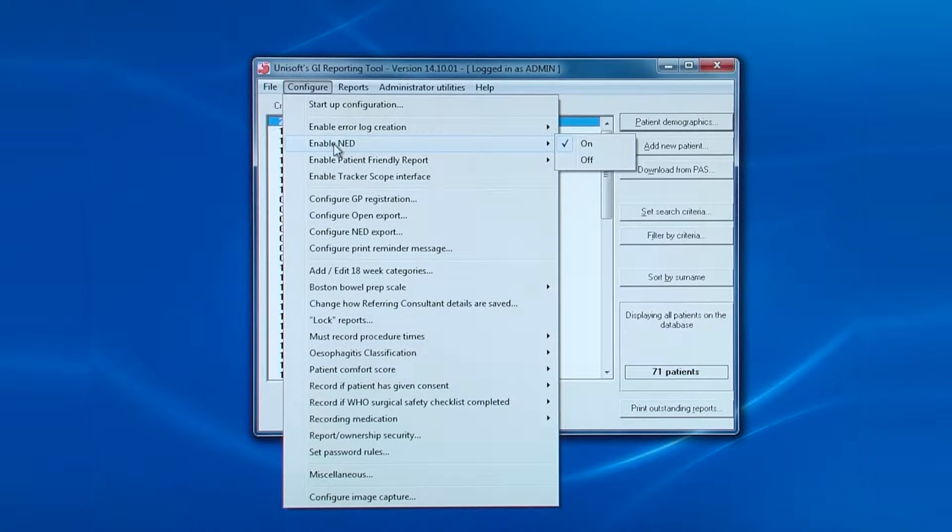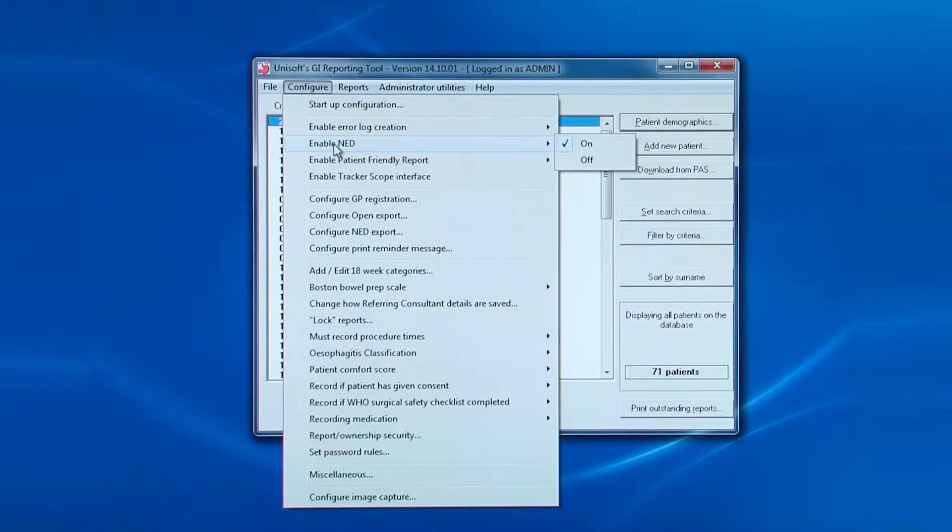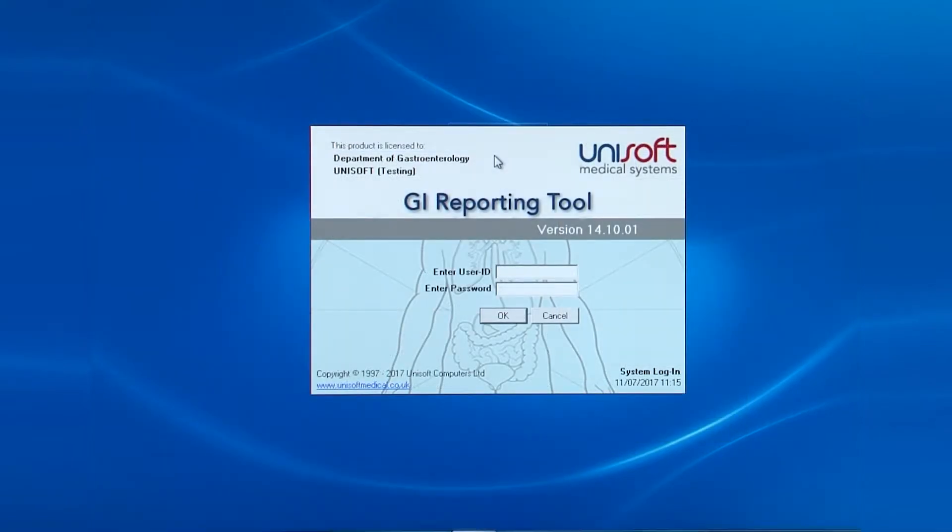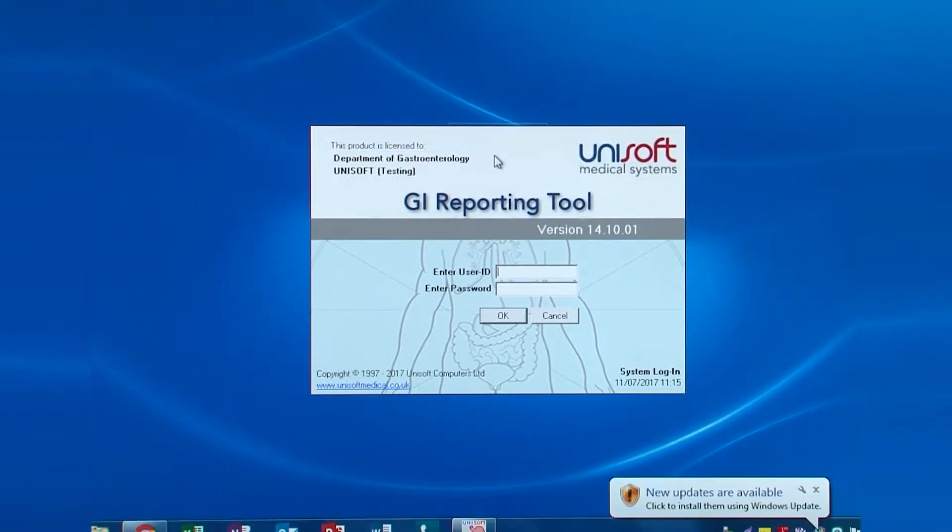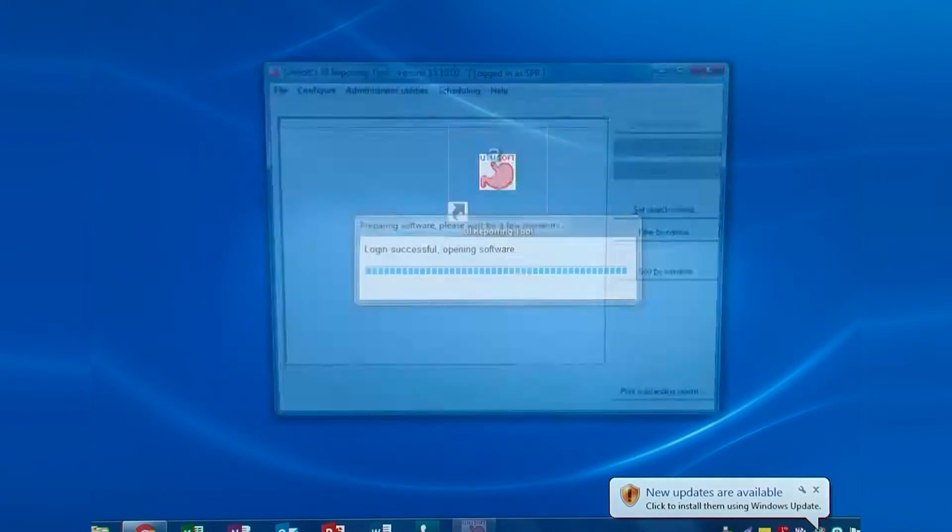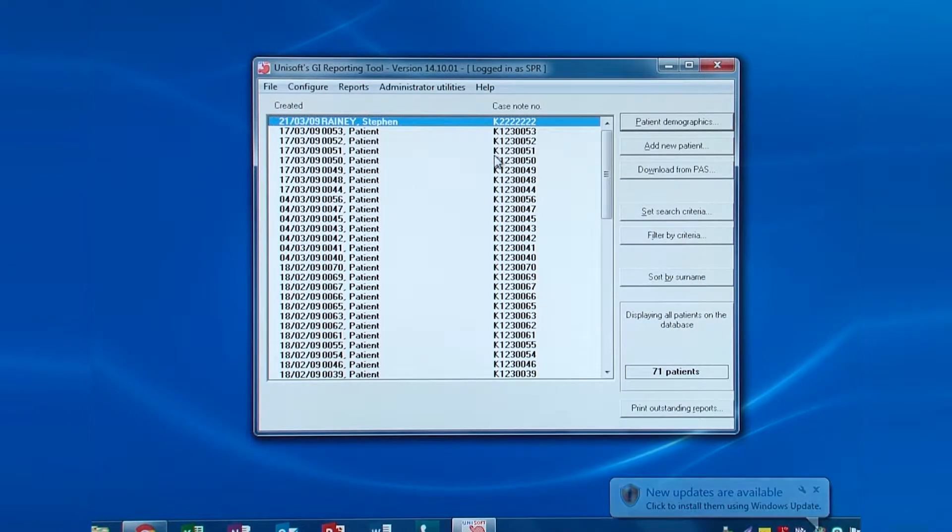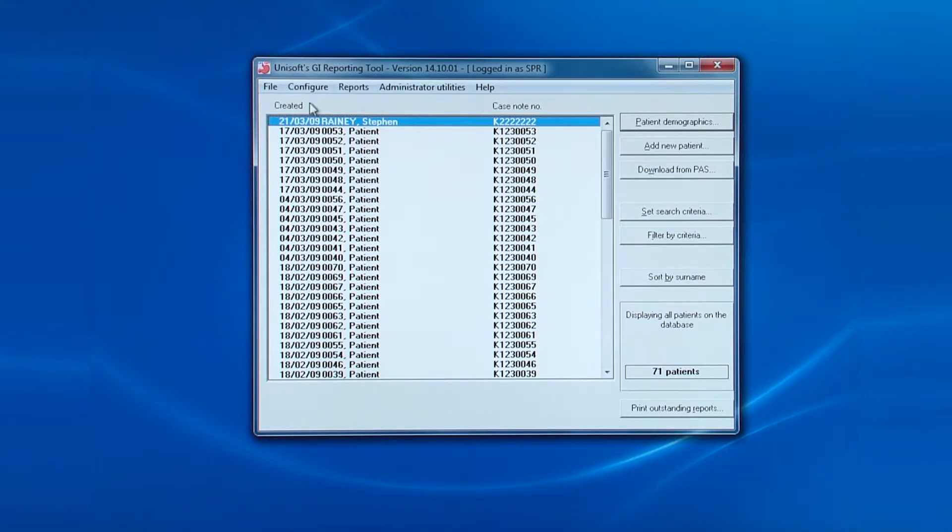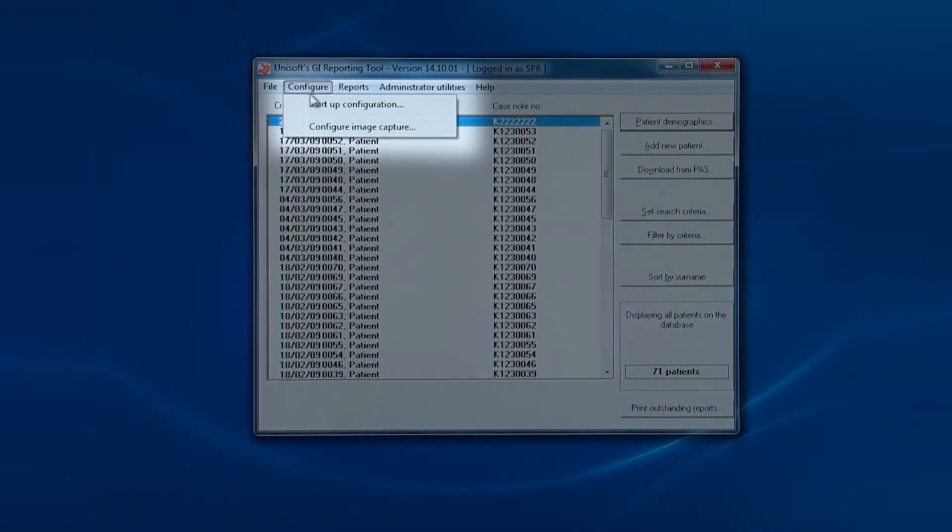So now let's look at the configure options for regular administrators. When any user logs in, including administrators, all of the main configuration options are not visible. There are just two options: the startup configuration and the image capture configuration.